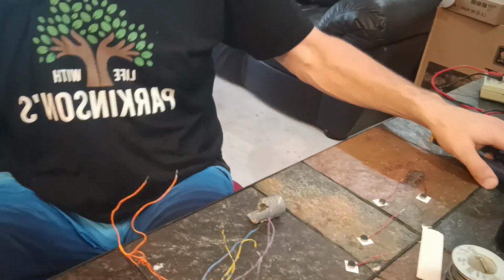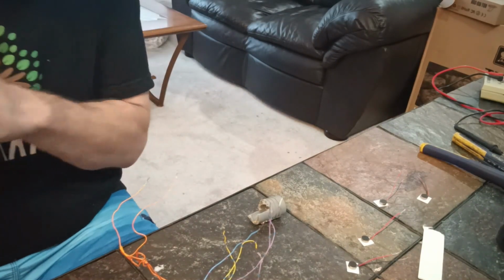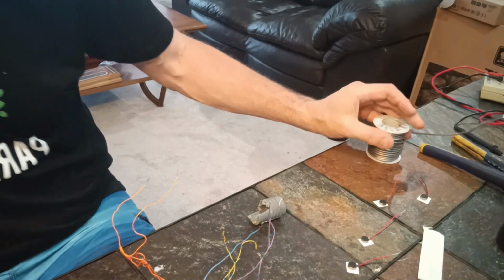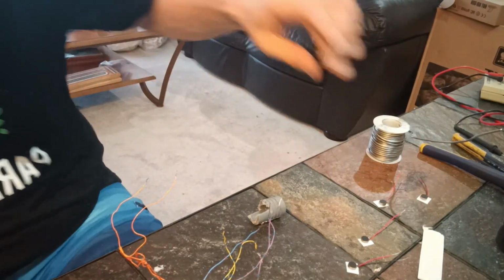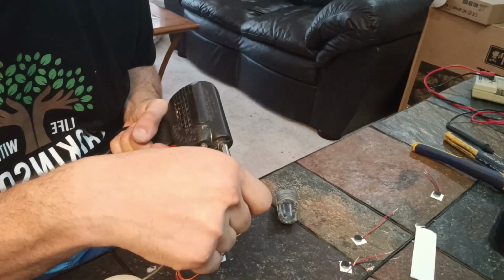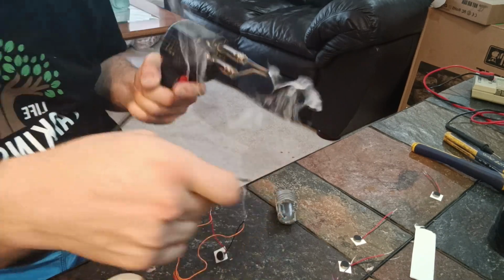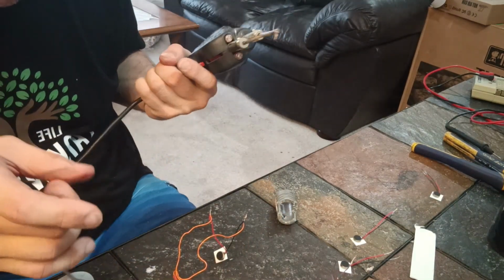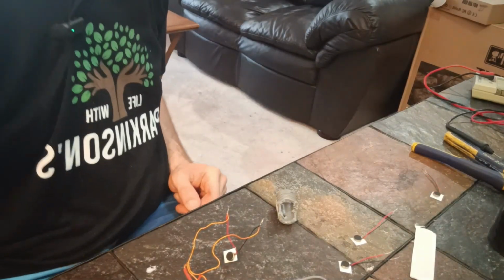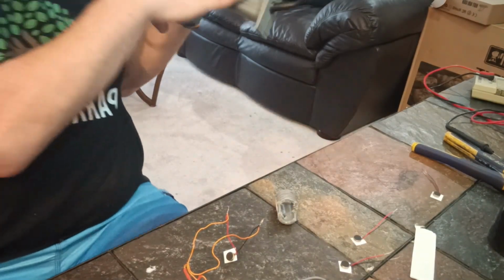Okay, time to set up the soldering iron. Here's the solder. Okay. So now we are going to start soldering these connections up. 1, 2. I'm going to get some heat shrink on there first before I move on to the next one, just to hold these things together.